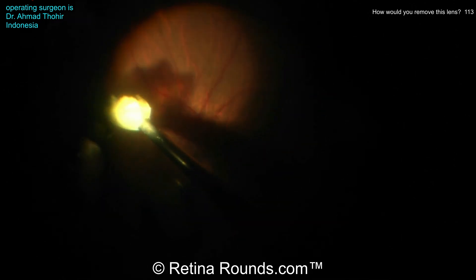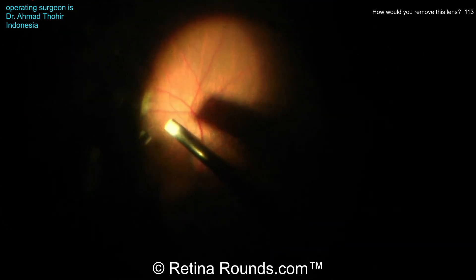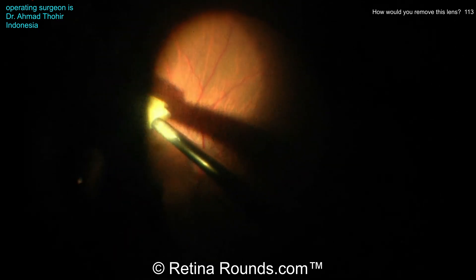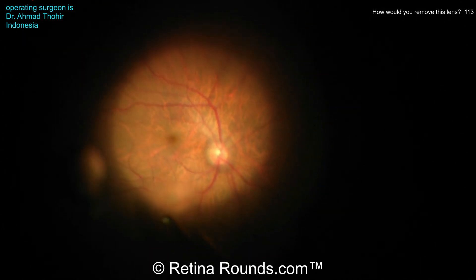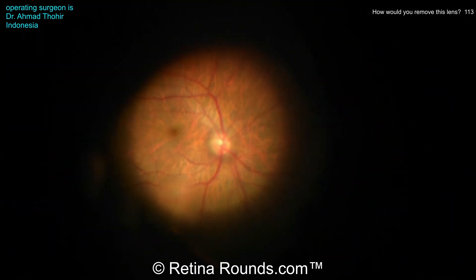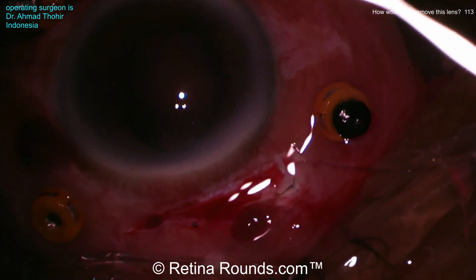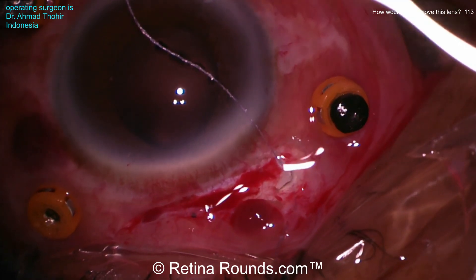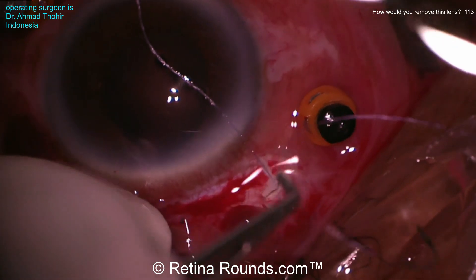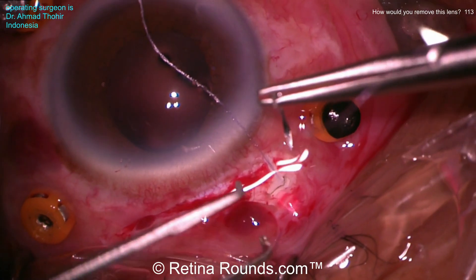Dr. Tohir is being very patient here and doing a great job removing these residual pieces — it looks like it's largely just nuclear fragments remaining, as the cortical material appears to have been removed. Now checking to make sure there aren't any other fragments. These little fragments can get stuck in the anterior vitreous, so make sure to depress around peripherally and check for any small fragments that may still be present, because if left behind they can result in chronic post-operative inflammation. Once the fragmentation is done, Dr. Tohir is going to sew the sclerotomy closed, which is one of the advantages of using a separate sclerotomy rather than enlarging the trocar sclerotomy, as this wound can be more completely closed and sealed for the remaining parts of the surgery.